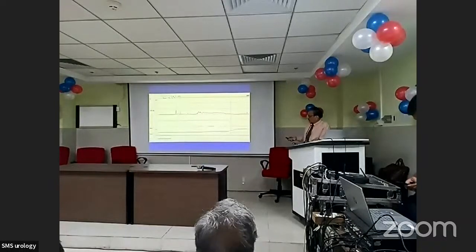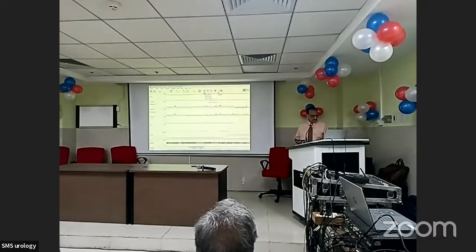Again, to find out the quality of traces: she coughs, there is a leakage, the traces are fairly good, transmitted well, with good subtraction. This is a case of pure stress urinary incontinence. You may account for the low pressure voiding, and this is something I also want to come back to. Look at this: this is the filling phase, the storage phase. No rise in pressure, perfectly fine.